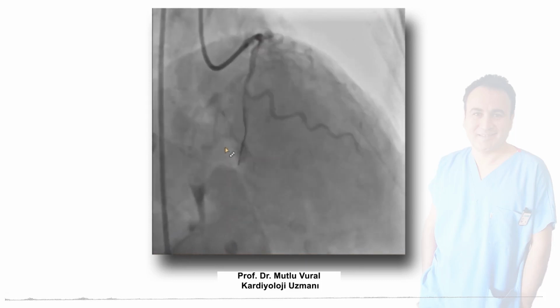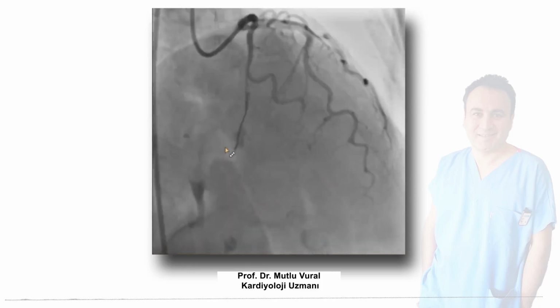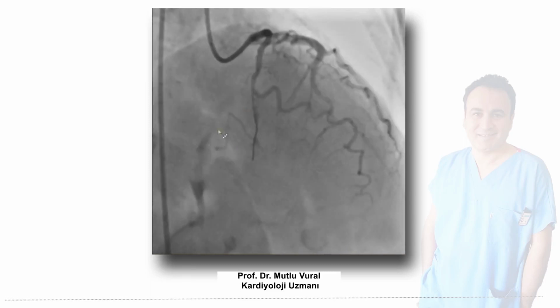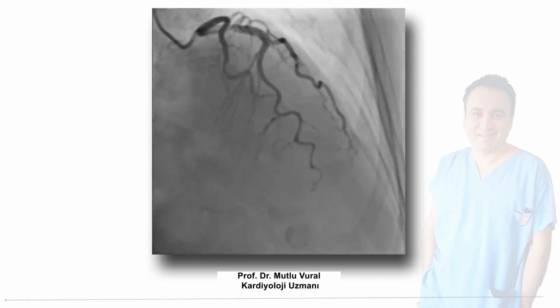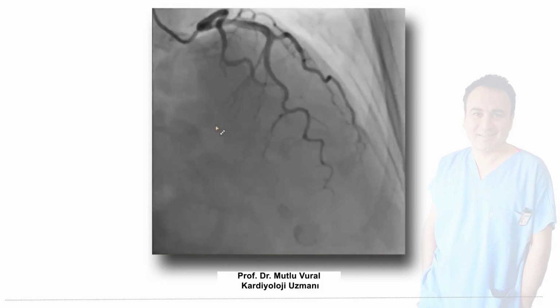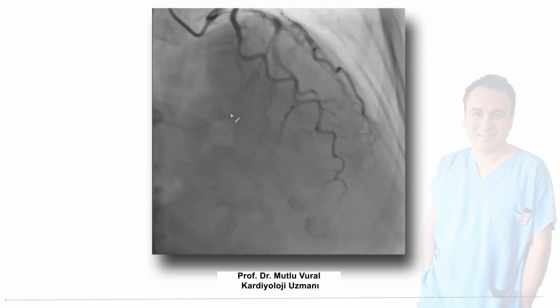I was not in the cath lab. I'm only discussing angiographic images. I don't know the clinical presentation of the patient, but actually, after dilatation of the circumflex before the bifurcation, perfusion in the OM branch increased. It was enough in this patient. This is previous angio. There is no big branch here, only small artery.